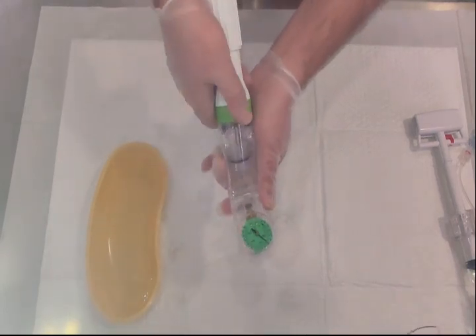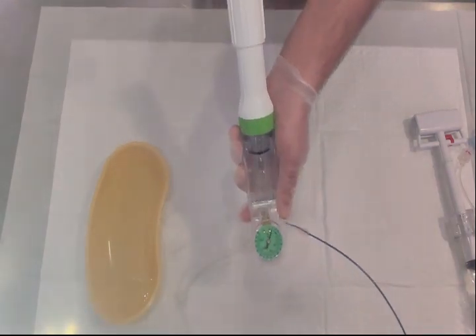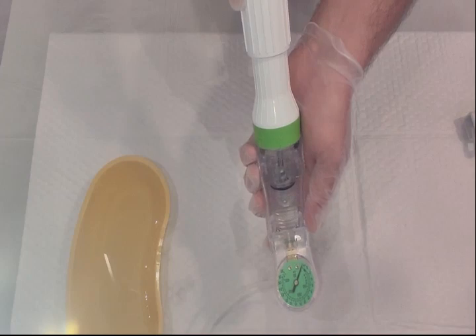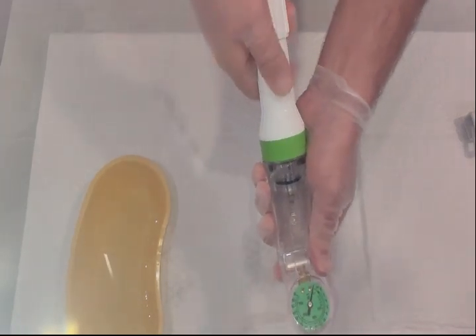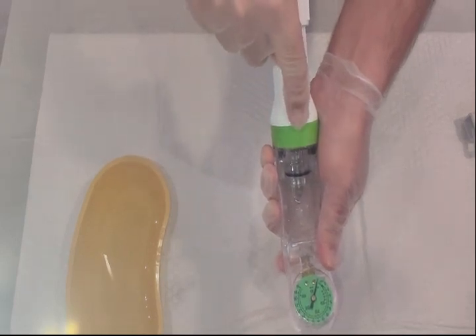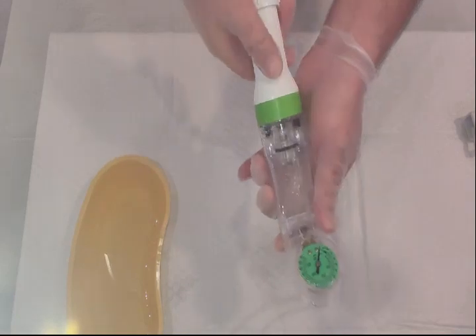To deflate the balloon with the second device, unlock it, retract the piston, then lock again. There is a lock symbol and an unlock sign on the device for reference. In this way, the balloon is deflated and you can disconnect the device.